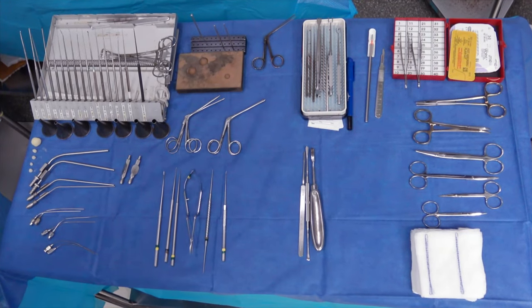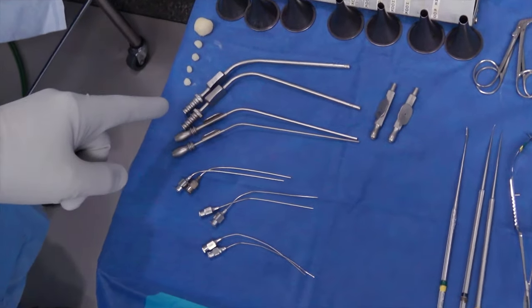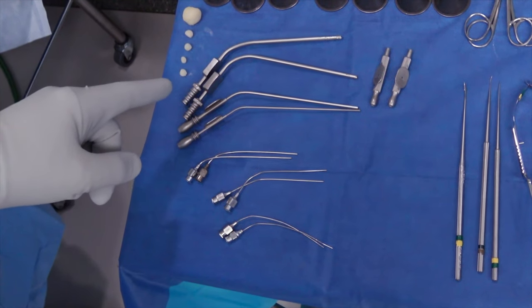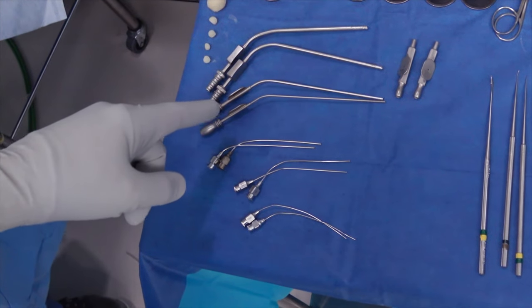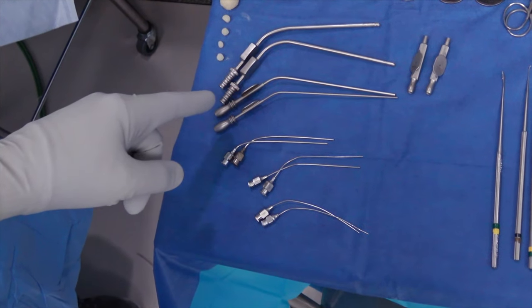Looking at our different instruments, these larger suctions — particularly the top two — we'll be using for when we're drilling. The larger caliber is better for suctioning up bone dust without getting clogged too frequently. Then these intermediate sizes, the size five and seven, are good for when you're just starting to work down the ear canal and trying to remove a little bit larger blood clots.